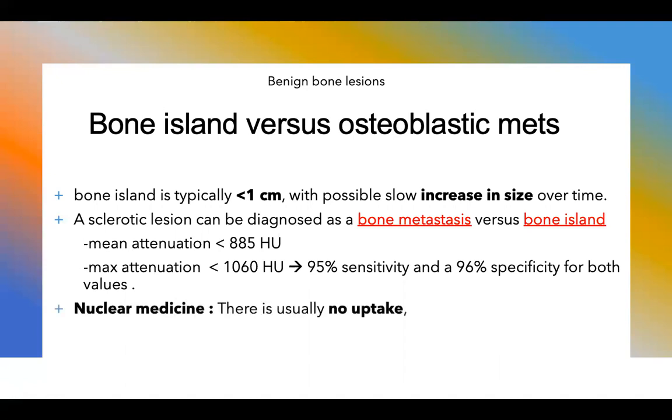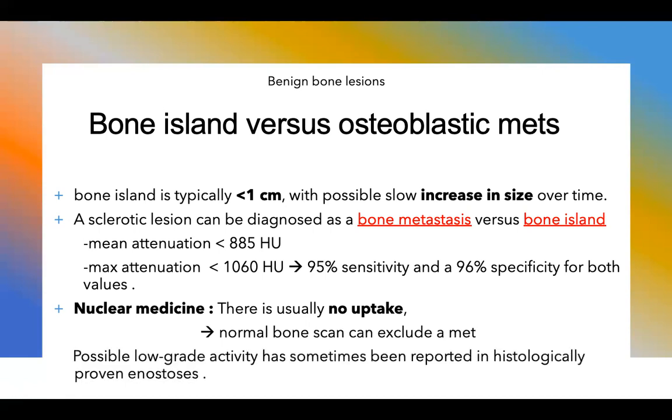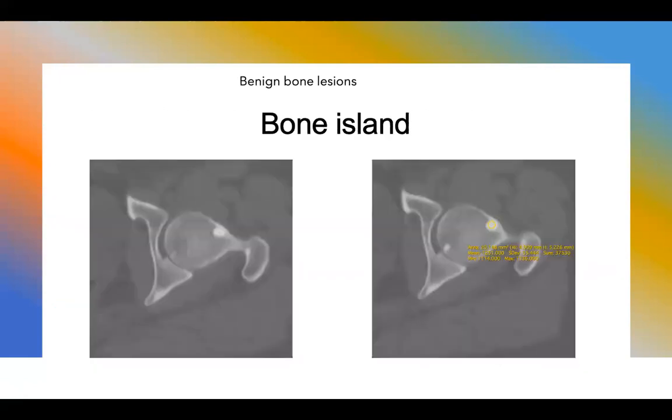In nuclear medicine, there's usually no uptake, so a normal bone scan can exclude the met, even though some low-grade activity has been reported in histologically proven bone islands.